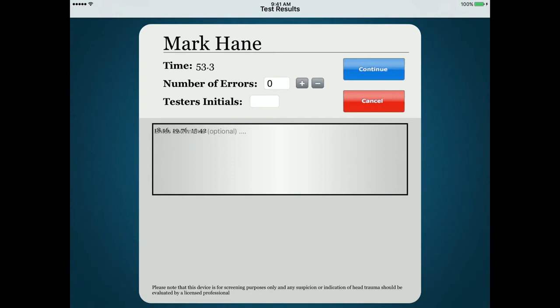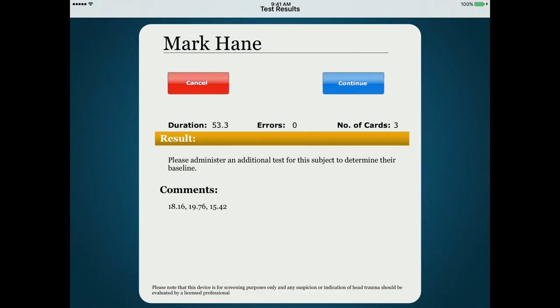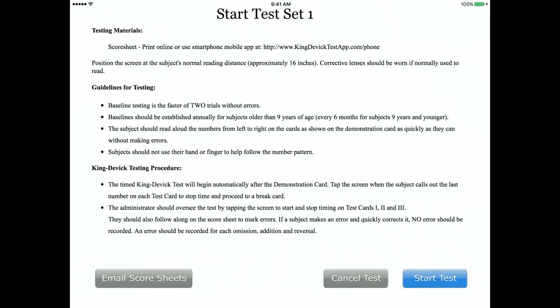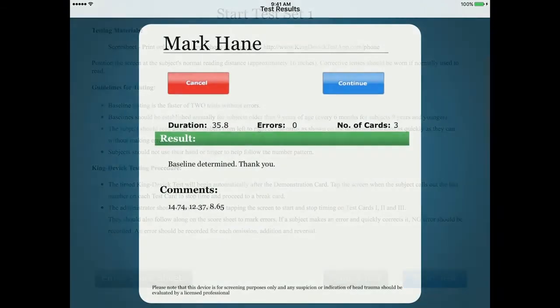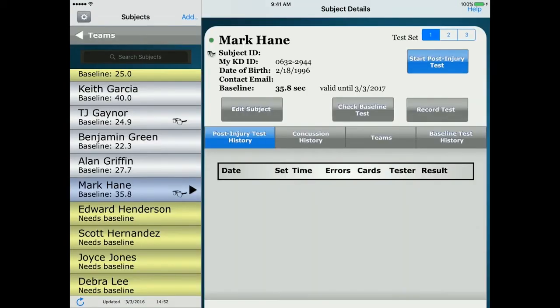Enter the total number of errors, your initials, and any comments, then press Continue. Follow the on-screen prompt to complete baseline testing. A minimum of two error-free trials are required to determine the KD test baseline score. Tap Continue to return and repeat testing until a baseline score is determined. When two acceptable baseline trials have been administered, you will receive a notice that the baseline has been determined. Press Continue — the baseline test result is now saved in the subject's baseline history tab.